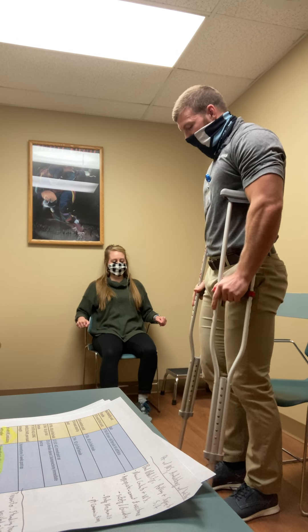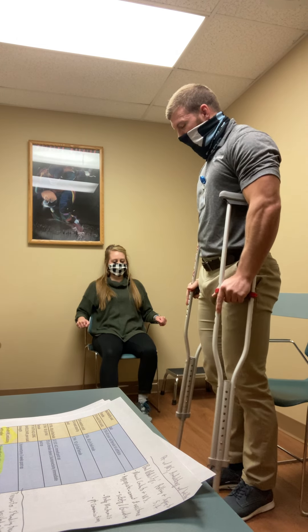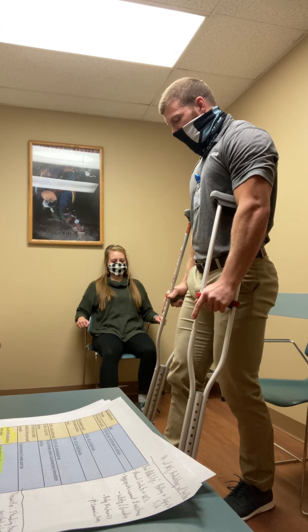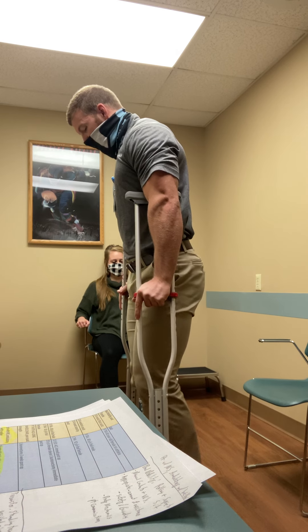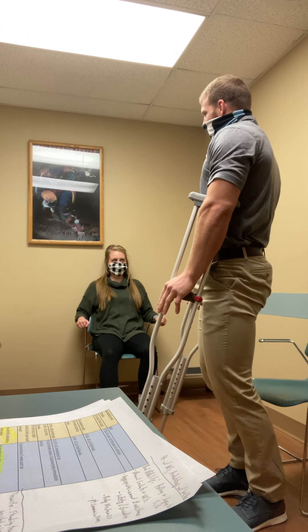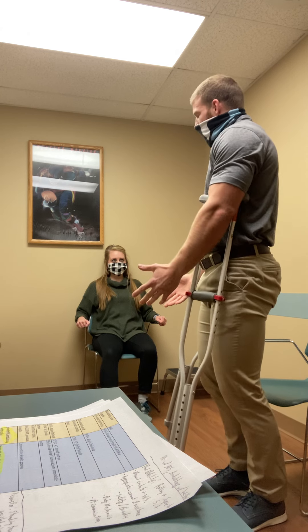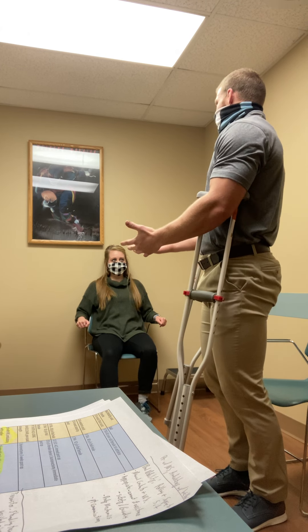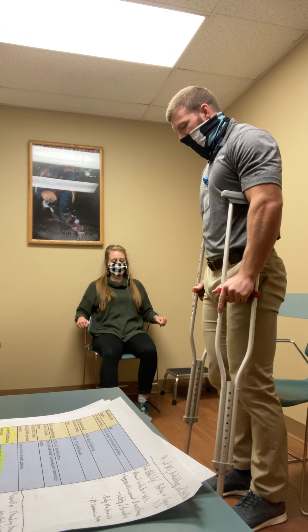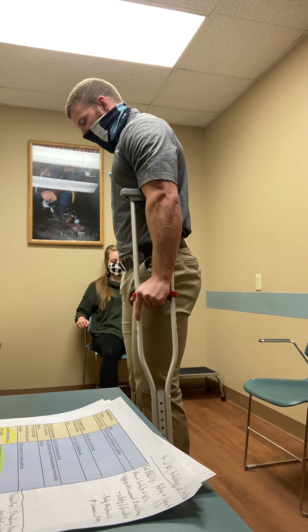With that right foot, I want you to think about that foot and the crutches as connected. As you step forward, stepping on that heel, the crutches are going to be with it. We're just going to do a step-two pattern to start. The doctor said weight bearing as tolerated, which means you're allowed to put as much weight on that right leg as you can — tolerable without your symptoms or pain increasing. So going about it nice and easy: crutches and that right foot are connected, stepping with that heel, coming together.